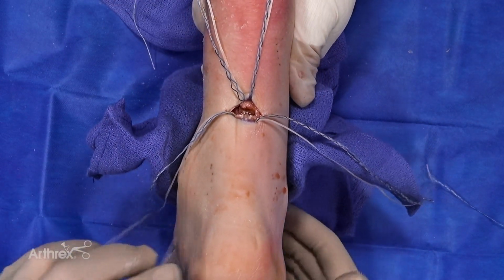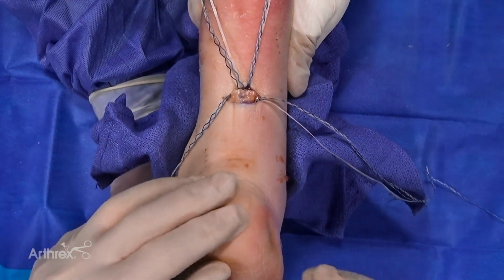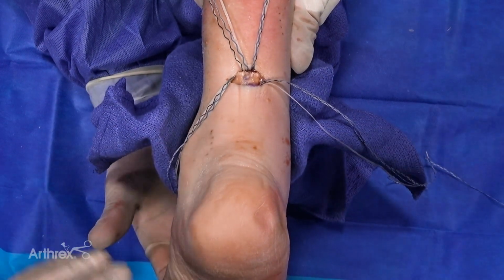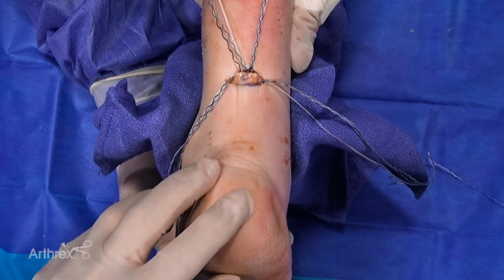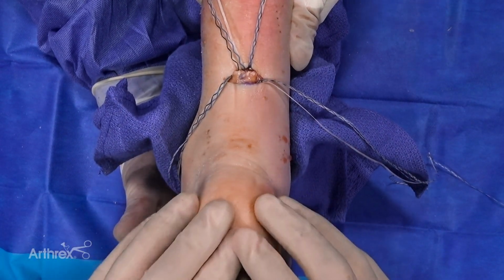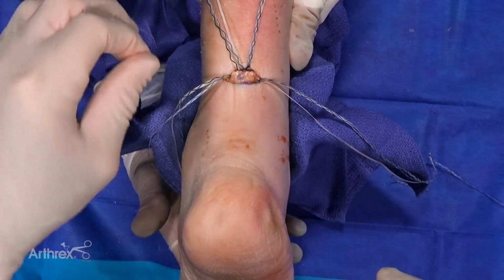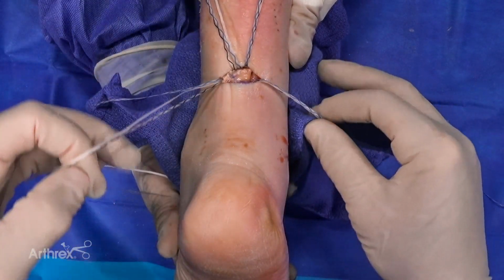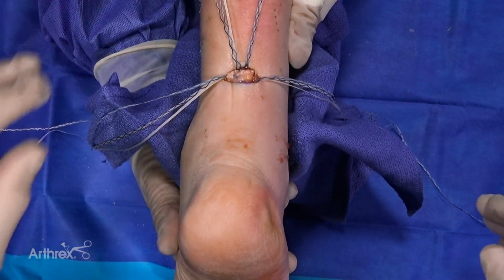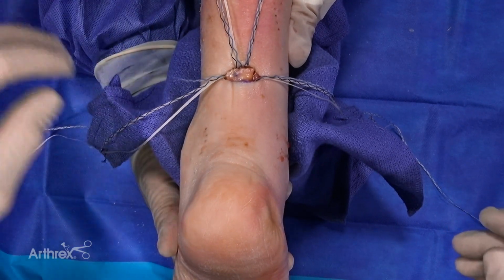What I'll typically do is then maximally plantar flex the foot. So again, I'm a maximum plantar flexion guy. I don't believe in necessarily trying to duplicate any kind of resting tension or comparing to the contralateral side. I've never seen an Achilles tendon repair over tighten. So for that reason, I want to secure these sutures in maximum tension. I'll typically secure my non-lock sutures first, and then my last suture that I'll tie will be the lock suture. So in this situation, we know our lock suture is the blue-white stripe.